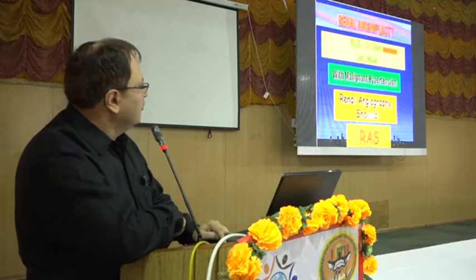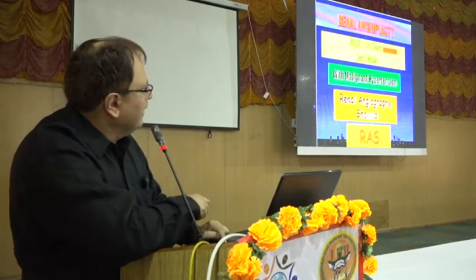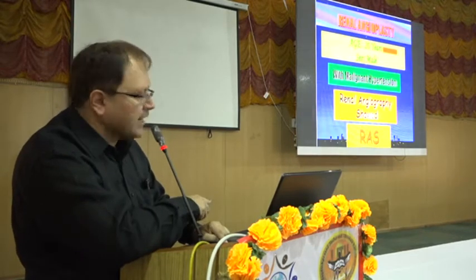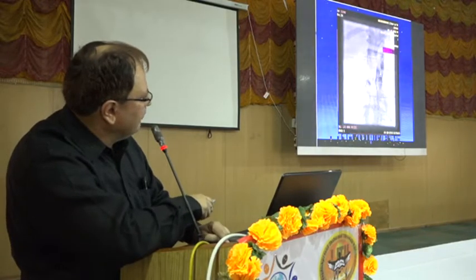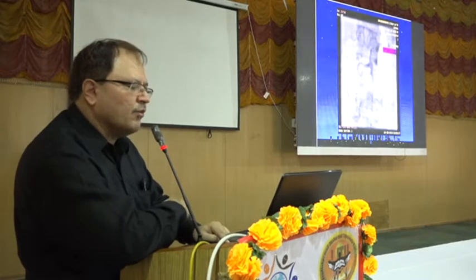Similarly, we have good results with renal angioplasty. A young male patient, 20 years old, presented with malignant hypertension. Angiography showed 99% renal artery stenosis, and we did the angioplasty. After angioplasty, he is absolutely fine. His blood pressure is controlled with only one drug.